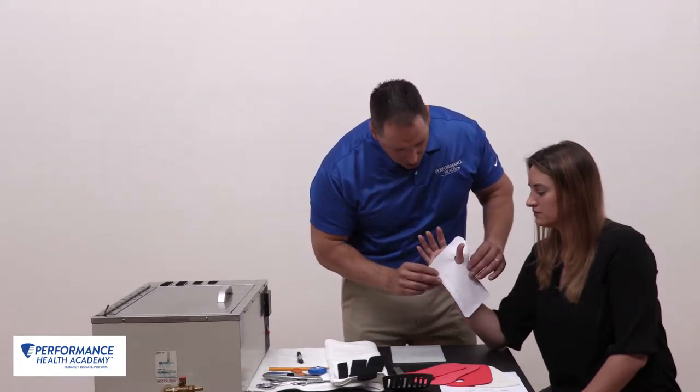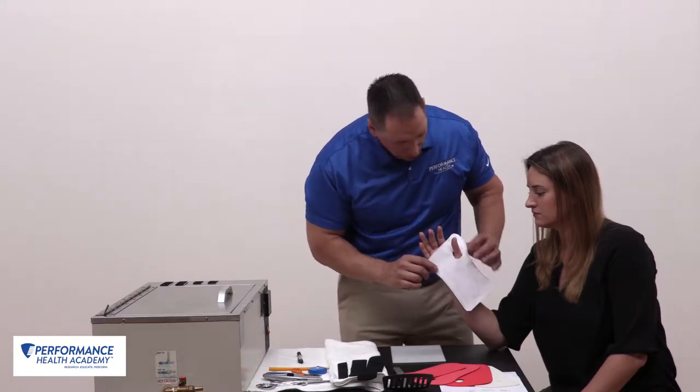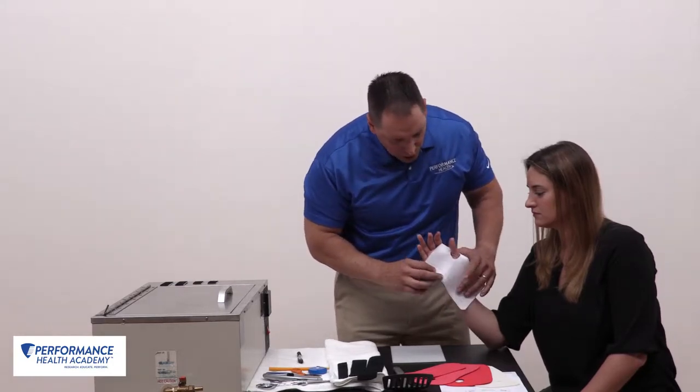We'll lay that over just below our distal palmar crease, around our fifth metacarpal, and this is going to be our dorsal piece right here.